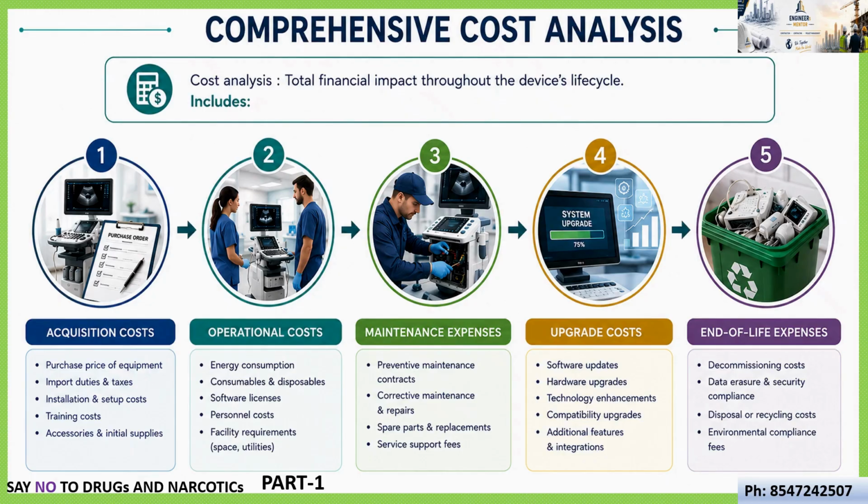So yes, there is a huge maintenance cost. The supplier itself has to be called for maintenance purpose. So then only the defect liability DLP will be valid. Like that, all the cost has to be analyzed before procuring the equipment.